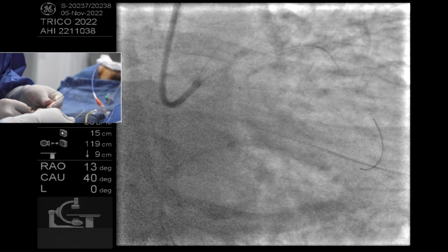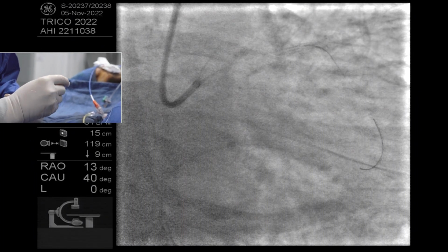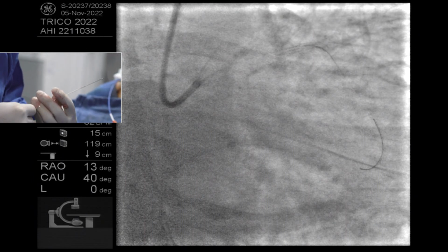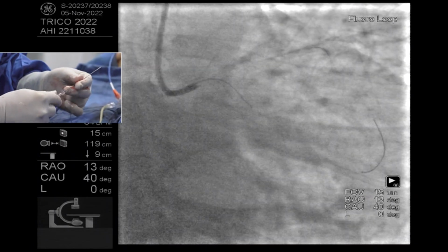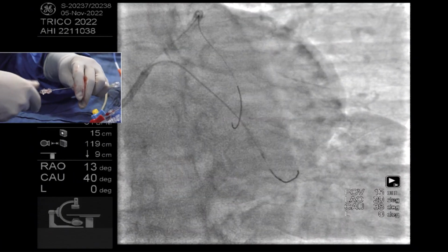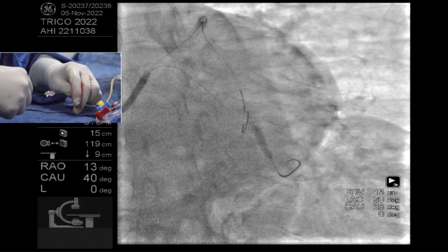There was some talk earlier of blocking balloons, and in my limited experience with those, the idea is more appealing than the actual execution. I think the blocking balloon is a very good technique, but it's more for entering, finding and supporting.